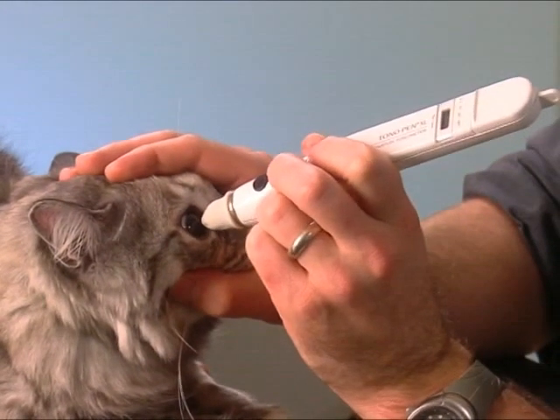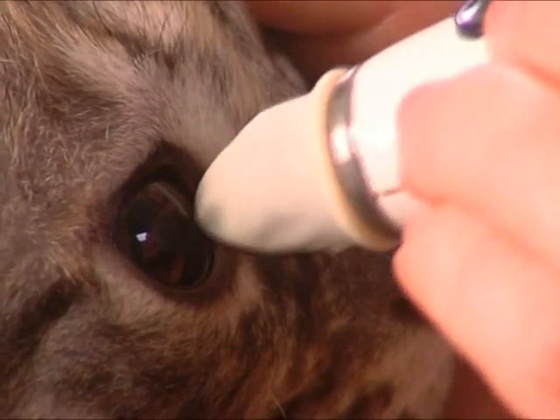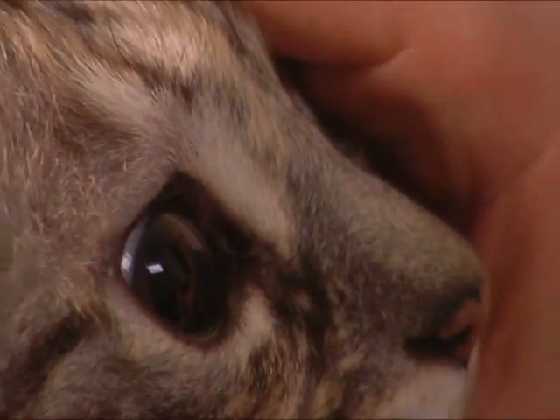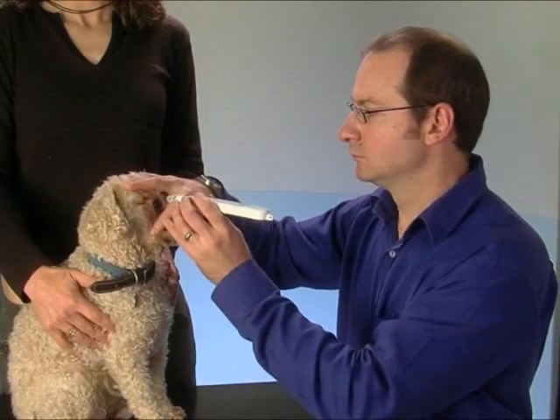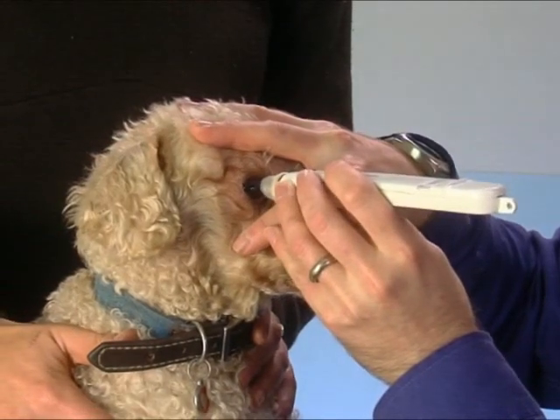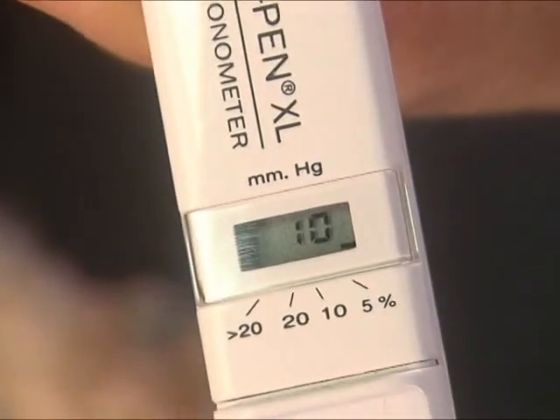Applanation tonometers, such as the Tonopen, measure the amount of force needed to flatten or applanate an area of the cornea. While expensive, they are convenient, accurate, and can be used with the animal's head in a normal position. The result is read off a screen, without the need for conversion.